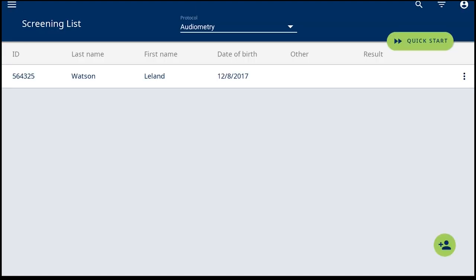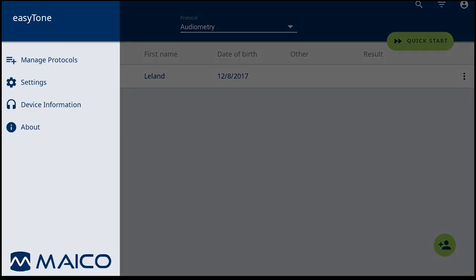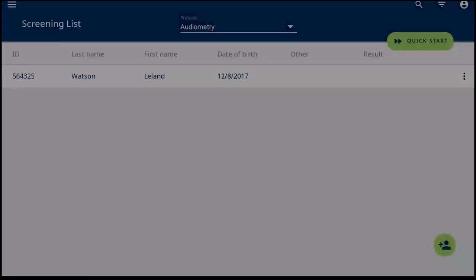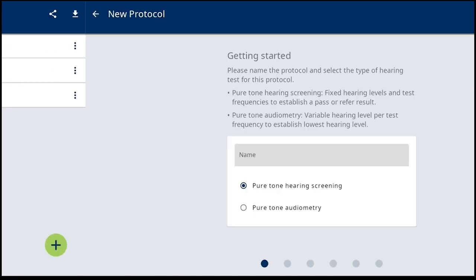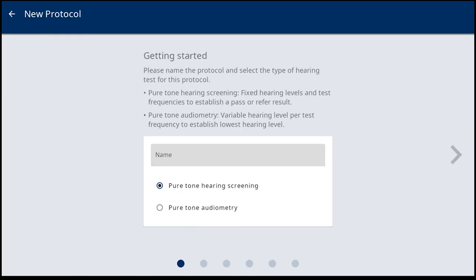The EasyTone provides easy setup and selection of your preferred test method through the protocol creation. Simply go to the Protocol Management screen, and when creating a new protocol, the first selection is the type of protocol to create.